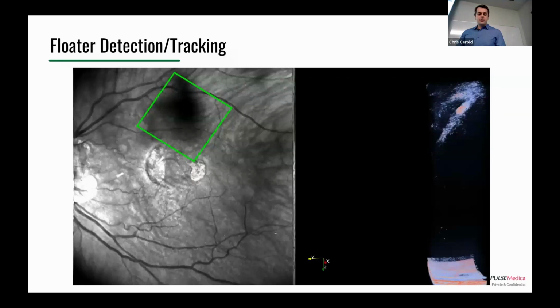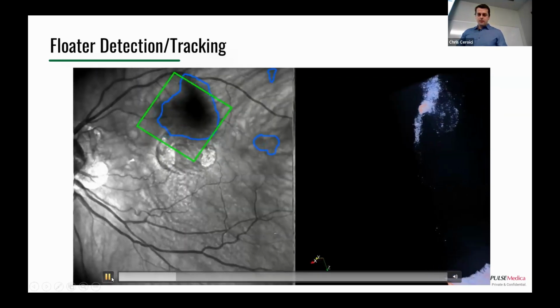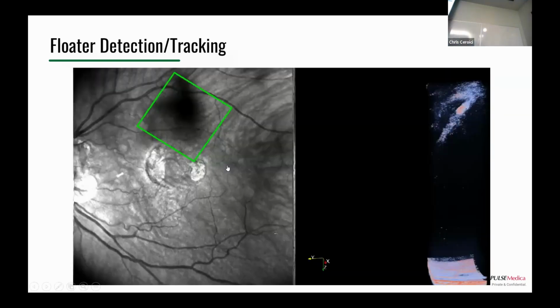Yeah, you might even be able to see a blink in this one. If it blinks, typically you'll see one of these slices is black or cut off or shifted. They probably did blink because it takes around 5 seconds to capture this volume. It's hard to not blink for 5 seconds, especially because most of the patients we image are over the age of 70. So usually it's not super obstructive.